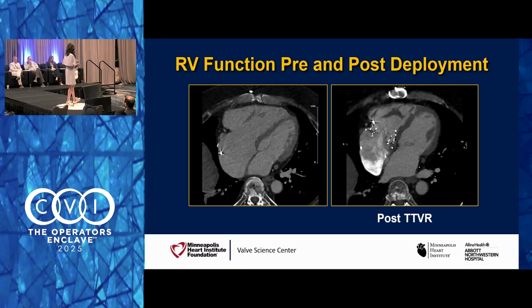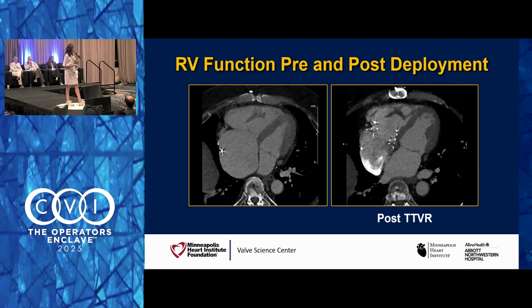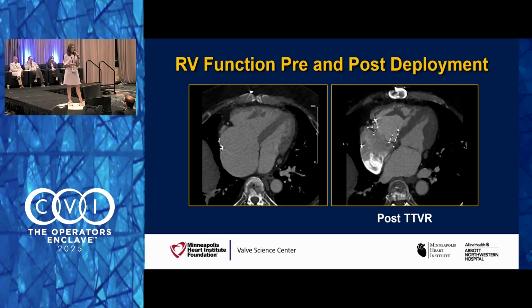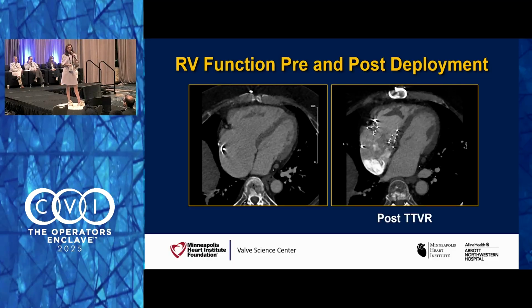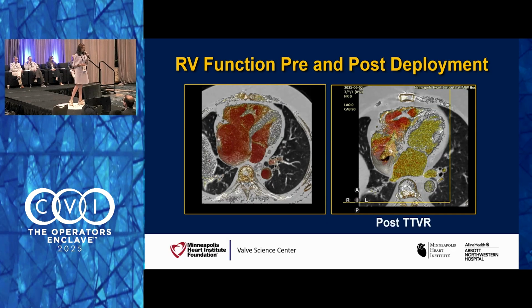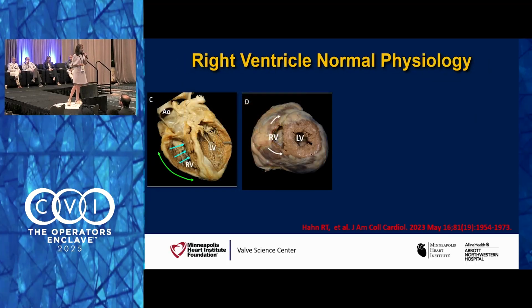And I think you saw him in clinic. He's doing remarkably well. And he's on anticoagulation for his TTVR, but he's certainly doing well. Certainly we'll follow up in terms of his RV, but he really has improved remarkably. So these are some CT images, thanks to Joao. So you can see here, really moving very well.